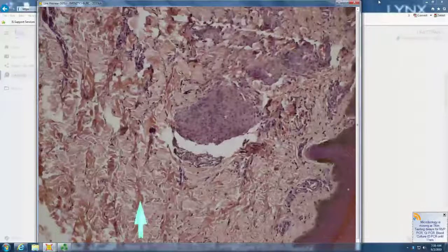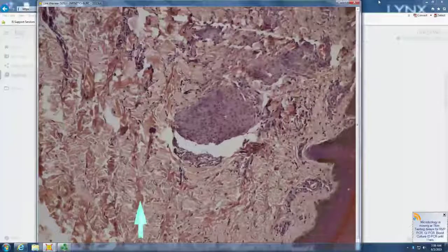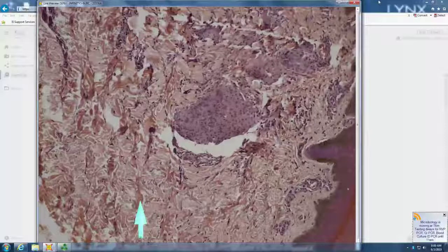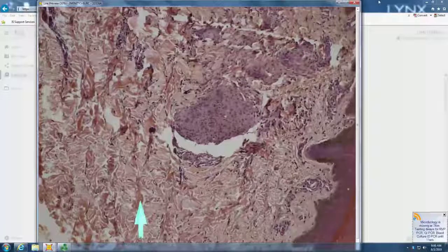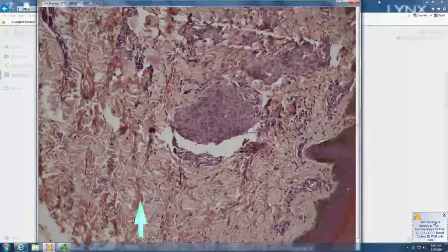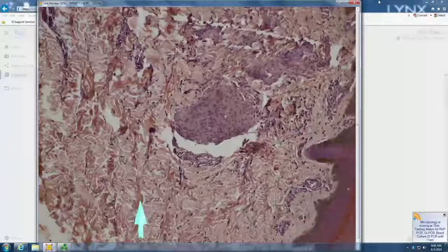Naked. They are naked, so you have naked granulomas, or since I was taught dermpath by Southerners, naked granulomas. So naked granulomas, what's your differential? So sarcoid. So sarcoid, what else? Infectious. Infectious, although infectious tend to have lymphocytes. Okay.